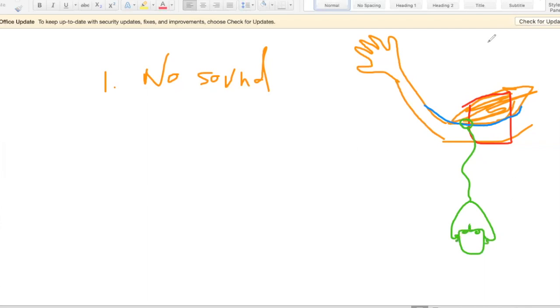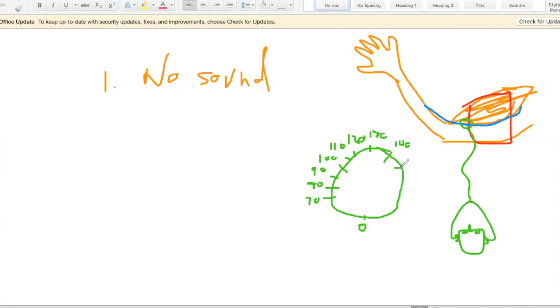All right, now I'm going to show you what the manometer says. Right now, the manometer is going to say zero. Over here is going to be 70, over here 80, 90, 100, 110, 120, 130, and so forth. May as well finish it: 140, 150, 160, 180. All right, let's just be done and make this one 220.